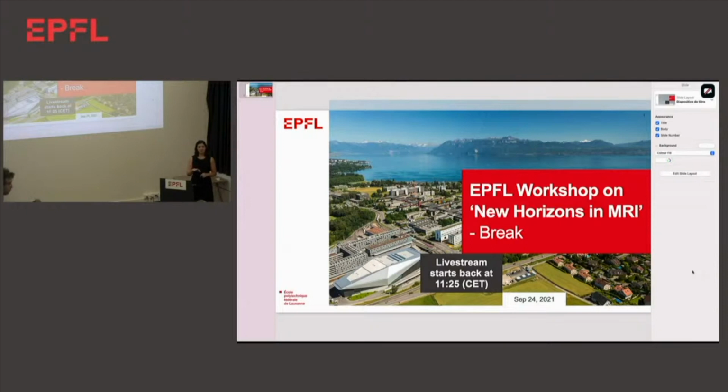The second issue is that unless you're using machine learning to make your dictionary, you have to choose some sort of increments for your T1 and T2 values. What we typically do is have smaller increments at the lower ends of the spectrum, and as those values get higher and higher, the increments get larger and larger, especially when we don't expect to see those values. But when they do pop up, say your signal evolution says the T2 value should be 250 milliseconds, but your dictionary can only choose between 200 and 300 milliseconds. No matter which one it chooses, it's going to be really off. And so you're going to end up with a really noisy result.